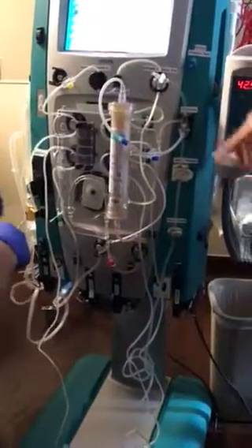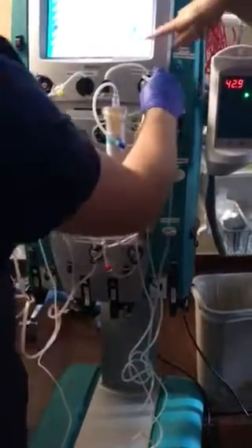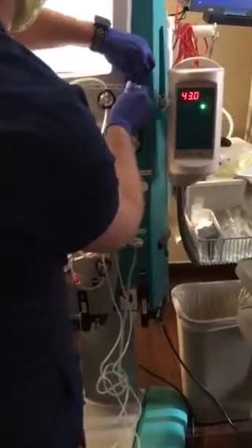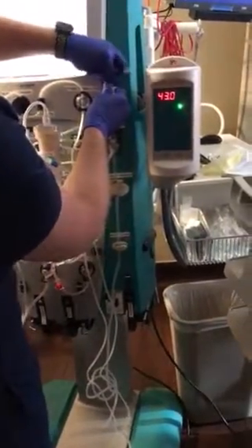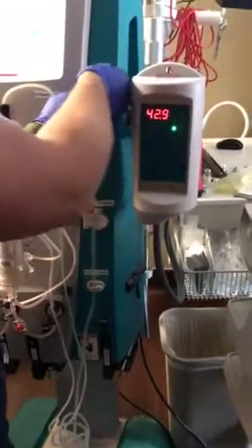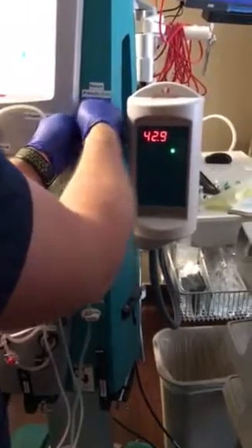What is going on? It's okay Bubba. Right now what they're doing is they're just setting up some equipment over here. We're just some extra nurses. We're just watching them set up the equipment. We're not doing anything to you.